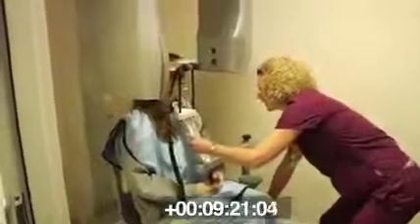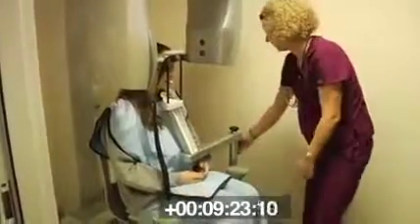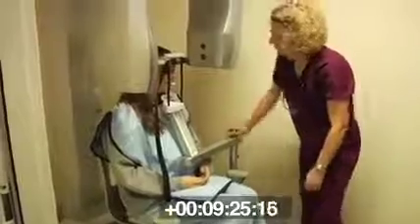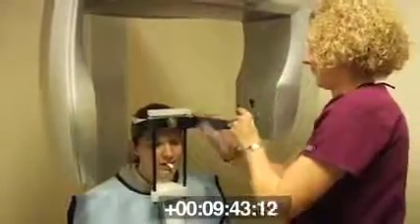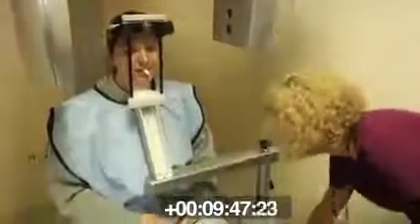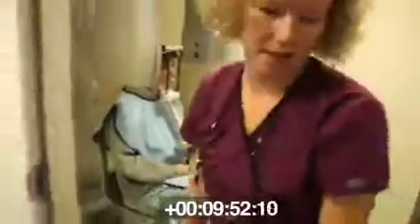Just sit real tall, small of your back all the way against the chair. Bring this up to your chin. Okay, rest your chin there for me and your forehead forward. Okay? Put up your ponytail here. Lock you in. Okay. Now sit real still for me. I've got a couple settings to set here.